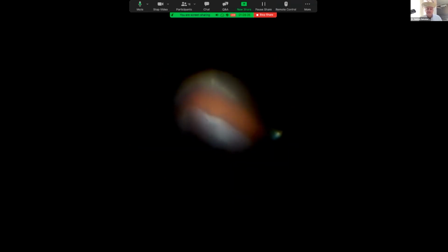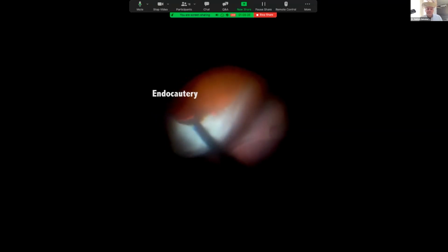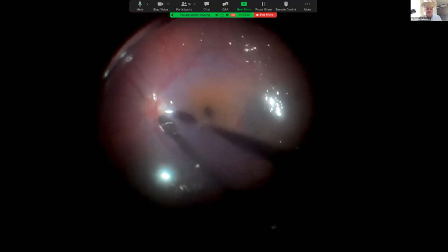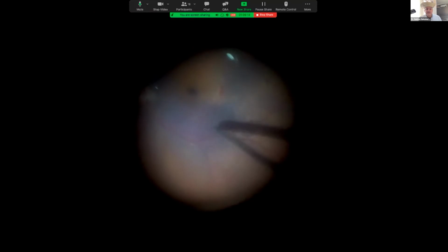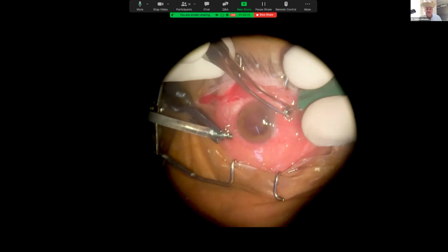So I leave it like that, and I'm going to work now to repair the retinal detachment. You see some tiny hemorrhage at the very periphery because the retina is very shortened. You have this PVR. I needed to do a relief retinotomy, otherwise the retina wouldn't attach. And I concluded with laser, two or three rows, and in order to avoid any slippage of the retina, I do a direct exchange of perfluorocarbon for silicone oil. And you see the final bubble there. We have to be very careful not to leave any bubbles there. And you see removing.